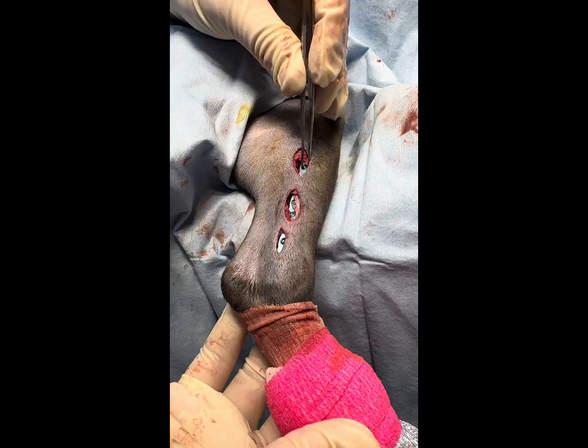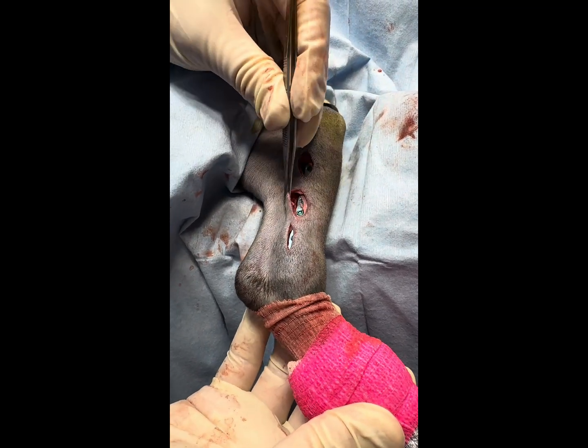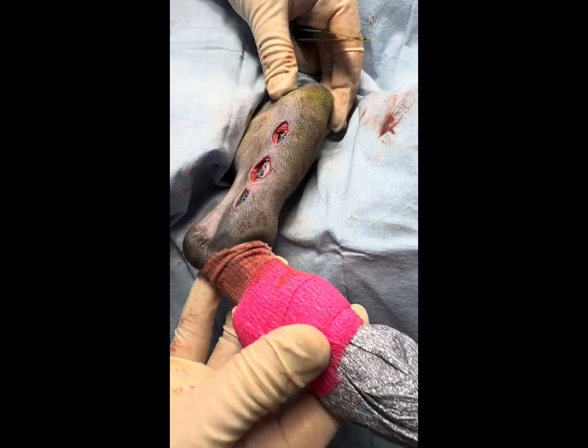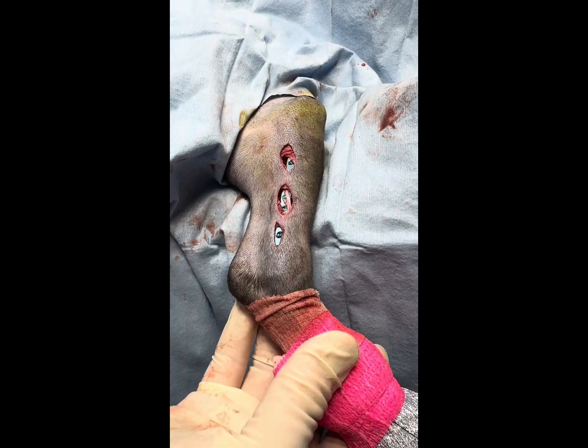Here we have the plate installed. You can appreciate just the three little windows that we used. We have good range of motion, everything feels very solid. This one should do really well.